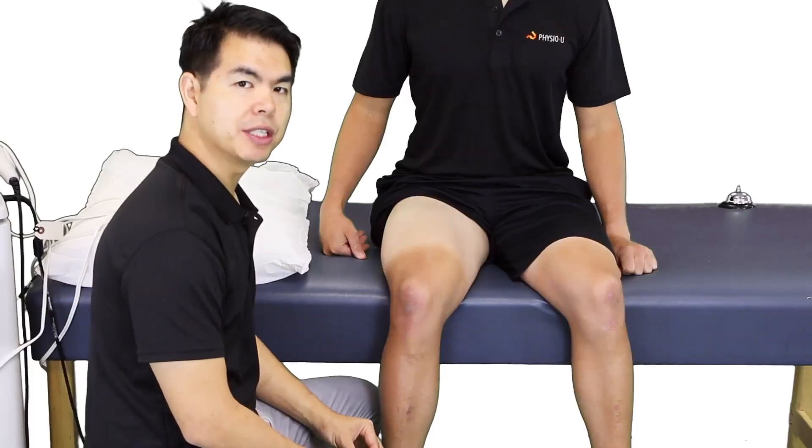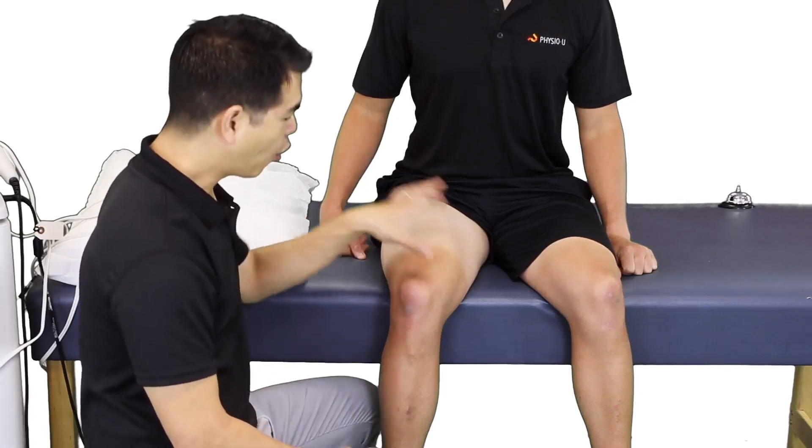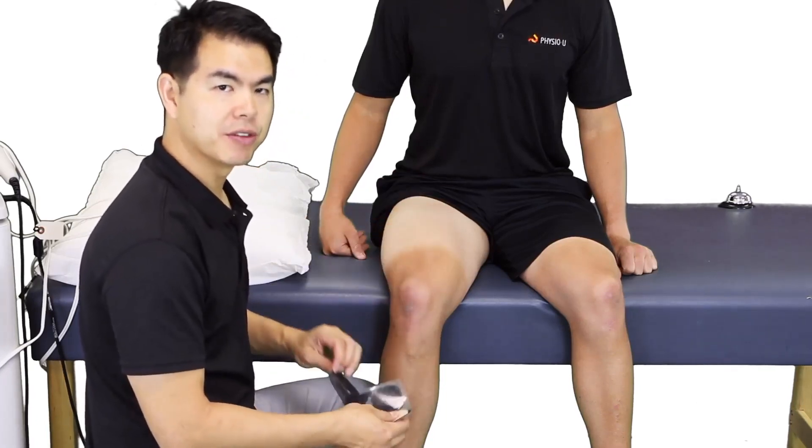For muscle stimulation, we'll apply the pads over the muscle belly parallel to the direction of the fibers.